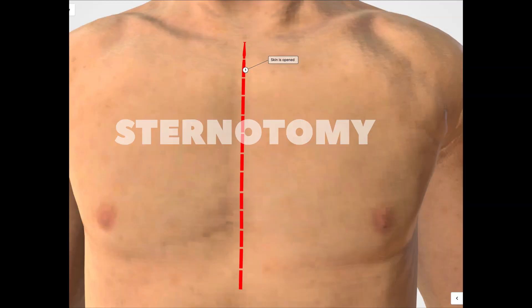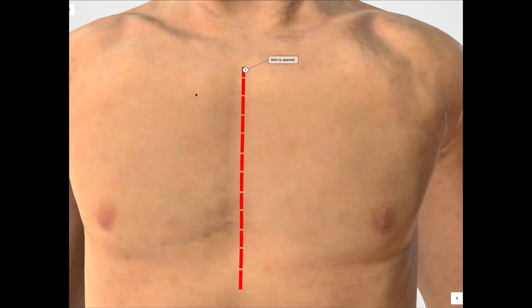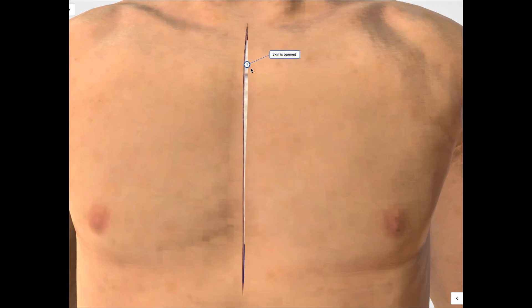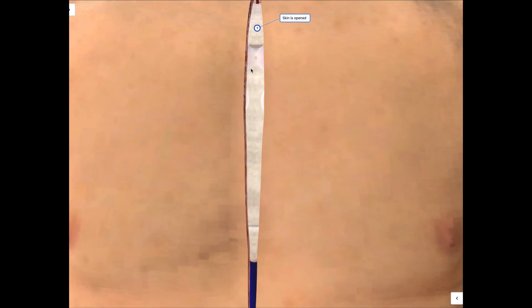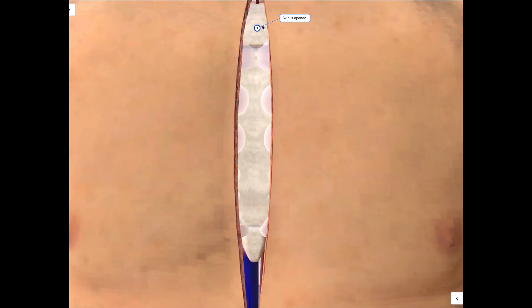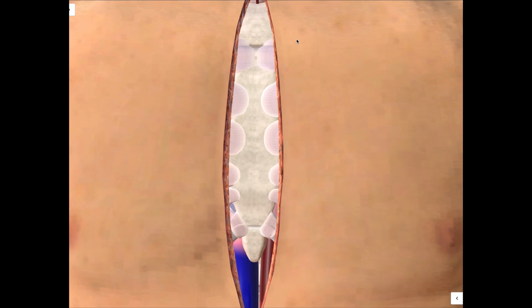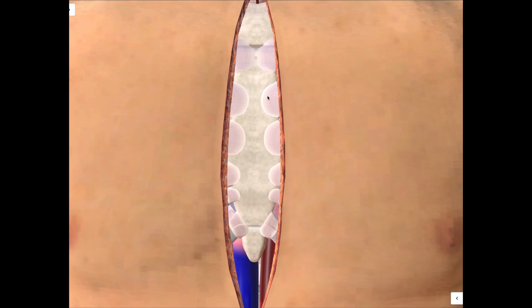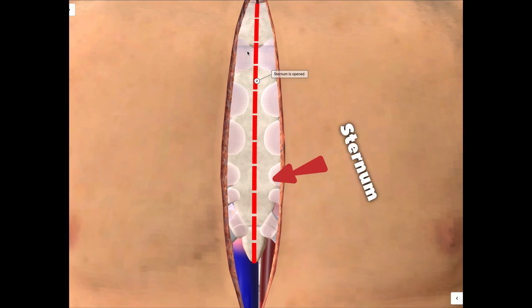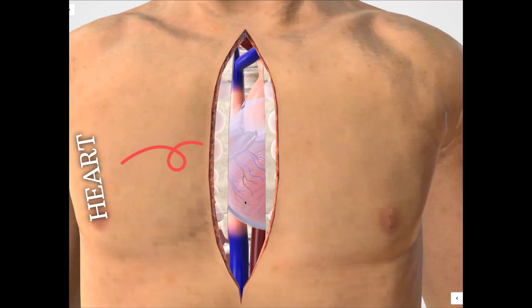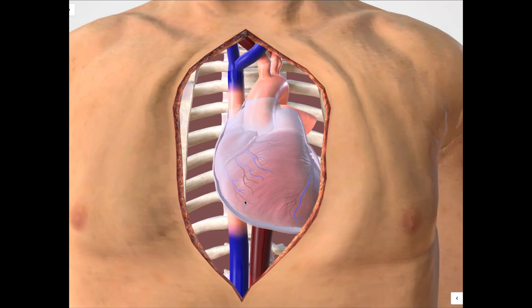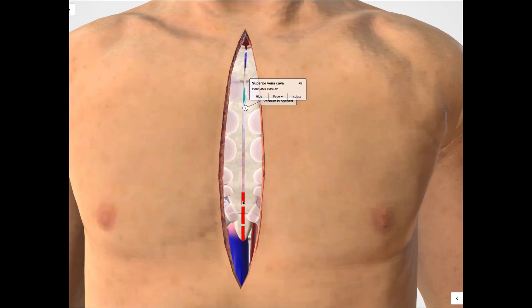A sternotomy is a surgical incision made vertically down the middle of the chest, directly over the sternum, or breastbone. The surgeon carefully divides the sternum to gain full access to the heart, lungs, and major blood vessels.